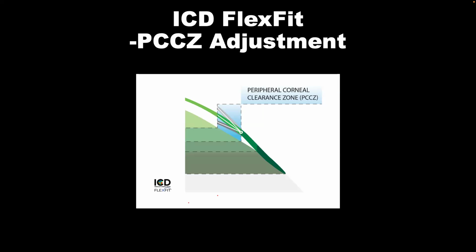Remember that you want to maintain the back posterior surface of that lens as smooth as you can and not have junctions between those zones, high or low, that will create kind of like a block here, here, here, here. You just want to go as smooth as you can on the back posterior surface.